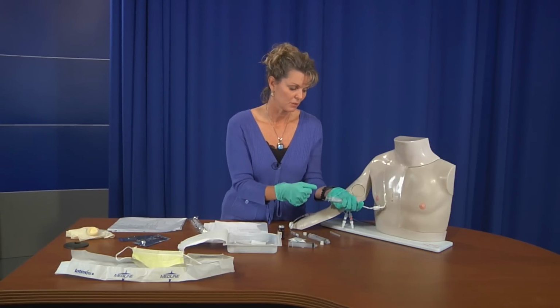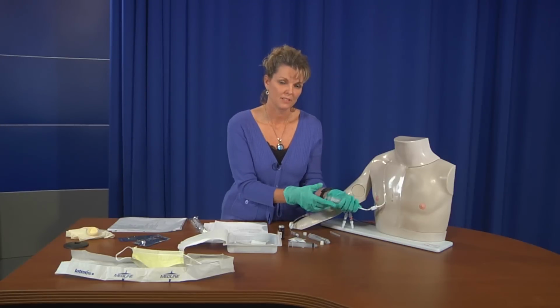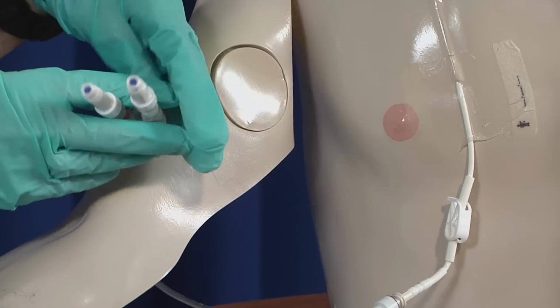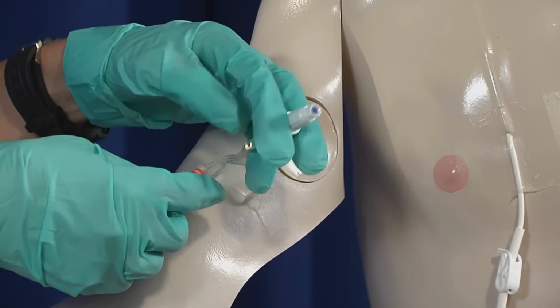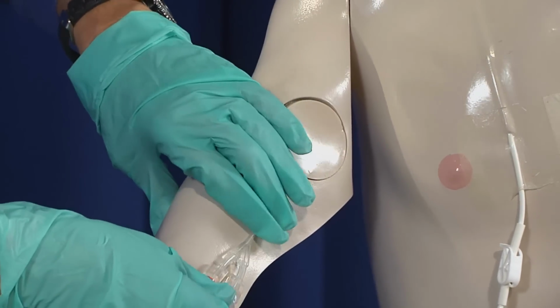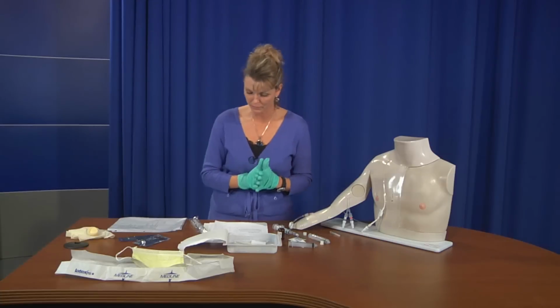If you're trying to withdraw blood and it's not coming out, it could be clotted. So in that case, you would then call the doctor to see if he wanted to use the declotting or not. Most of the time they have more than one port, and we'll go from using one and then it stops, or maybe it gets clotted off, to using the other. So most of the time we have more than just one to choose from, so they don't usually declot those. And that's it.